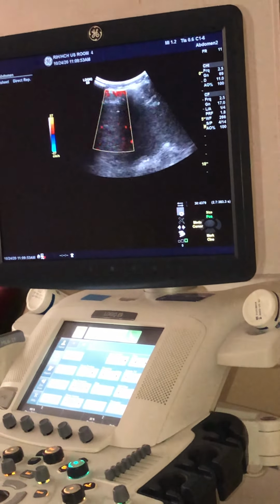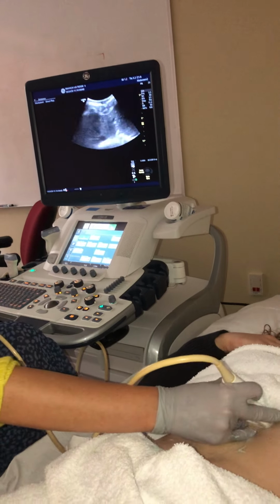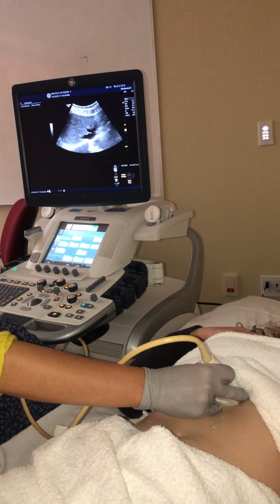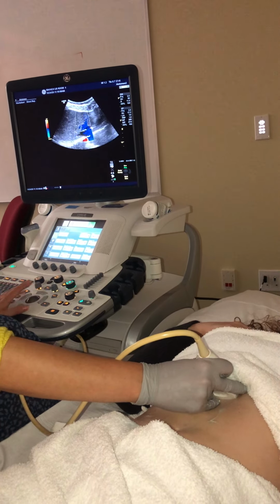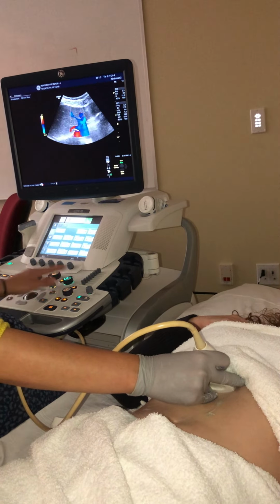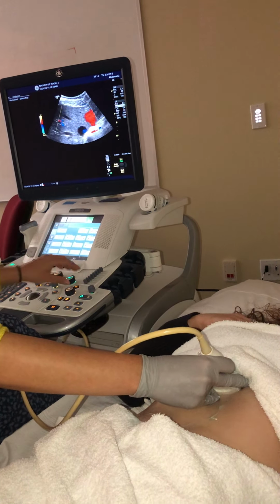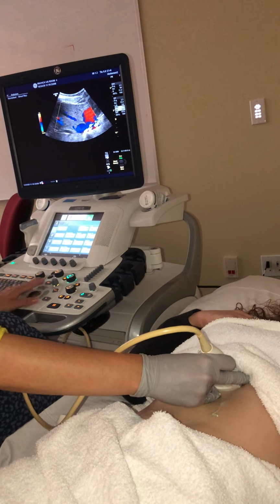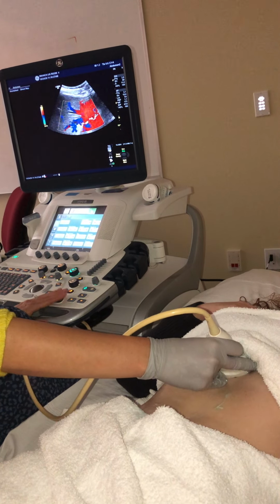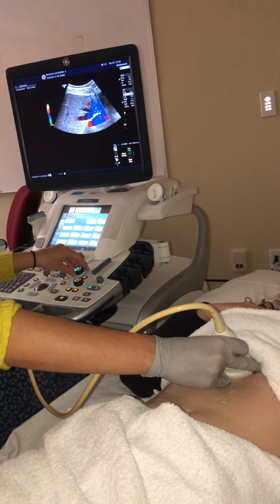And as for our hepatics, we saw those nicely in transverse, so we can use the same approach. We can go transverse left lobe, big breath and hold. Now we're getting a lot of this artifact because the hepatics are located so close to the heart, so we're getting some flashing from all of that motion at the heart.